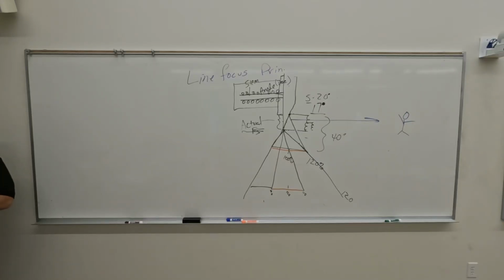Most rooms are going to be set up for most exams to take advantage of the anode heel effect. So when we say utilize the anode heel effect, it just means position the patient as you always would in most cases.